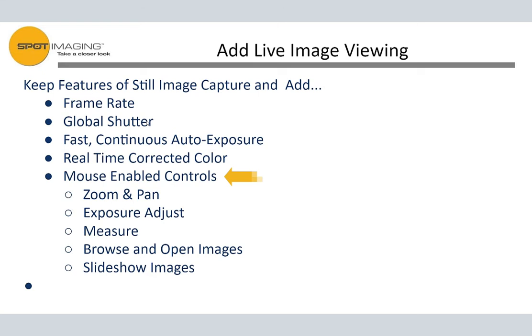While you're in live mode, you'd like to be able to pan and zoom in and pan around, and basically bring into focus, especially on presentations, or let's say you have a slide review where you're looking for concurrence, and you have several doctors there, and you're using that instead of a multi-headed scope. You want to zoom in on what you really want to talk about, as well as use your cursor. So having live digital pan and zoom is very important.